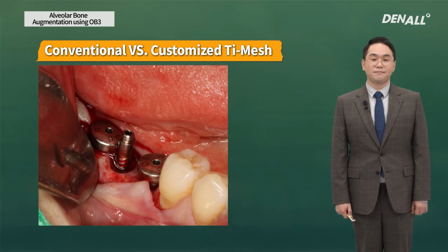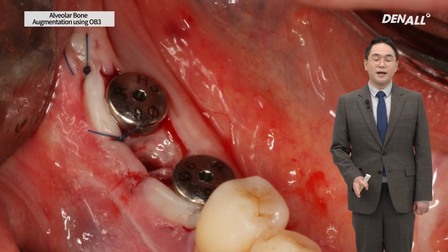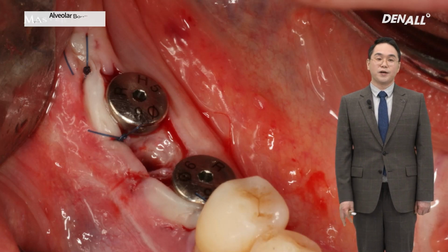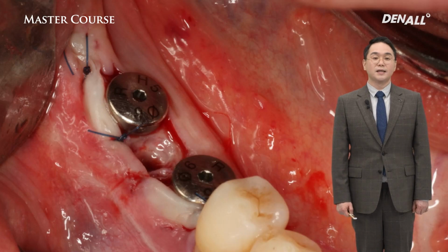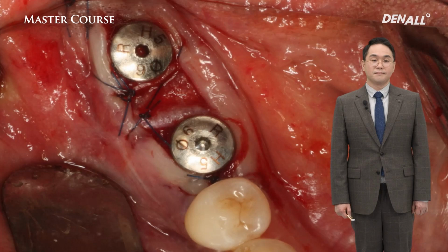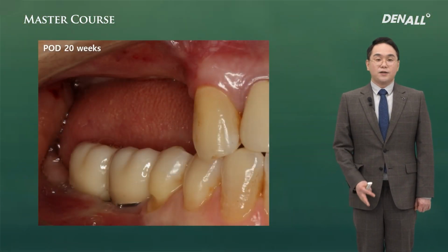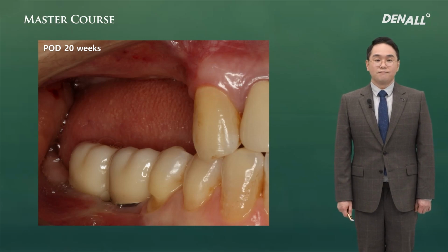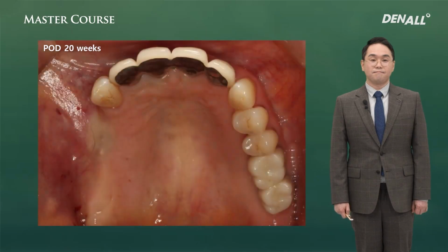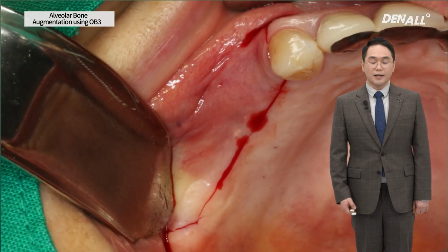It is easily removed. After that, healing abutment is connected and keratinized gingiva needs to be increased buccally, so apically positioned flap is also performed. After that, 5 months after operation, the final prosthesis in the mandible is completed and titanium mesh is to be removed in the maxilla. The maxillary titanium mesh is not exposed up to 5 months after operation.